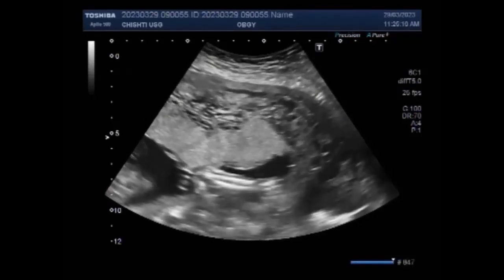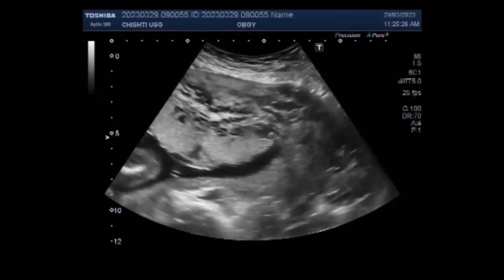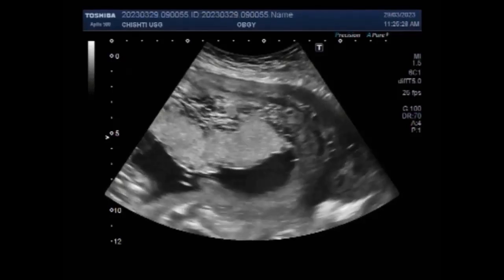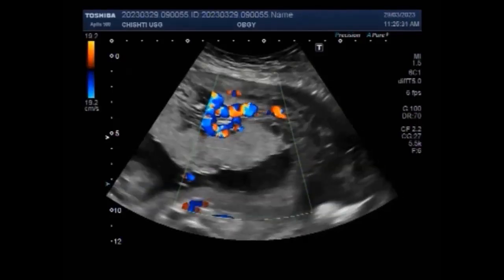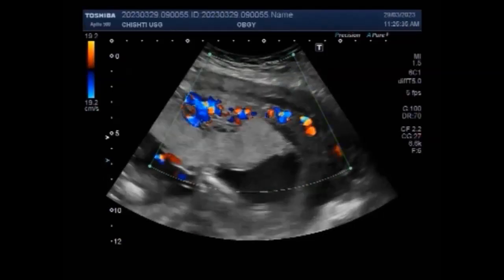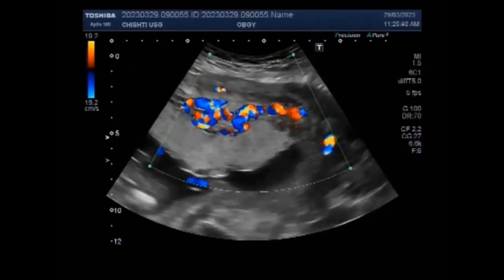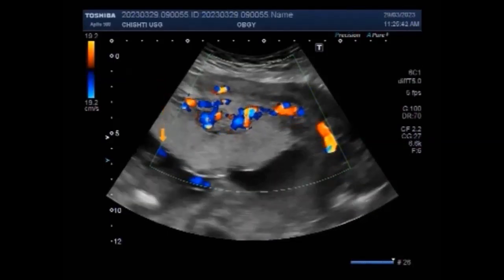Hydatidiform mole can be either complete or partial. The absence or presence of a fetus or embryo is used to distinguish the complete from partial moles. Complete moles are associated with the absence of a fetus. But in this case, the fetus is echo-morphologically normal and there is no fetal demise. The fetus is active, alive and viable.